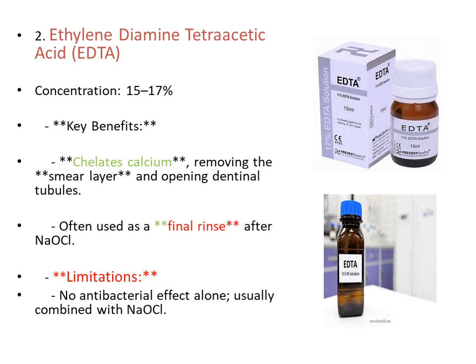It is often used as a final rinse after sodium hypochlorite, meaning first sodium hypochlorite is used and then EDTA is used as a second addition for getting a good canal without any further bacteria or dead tissues.